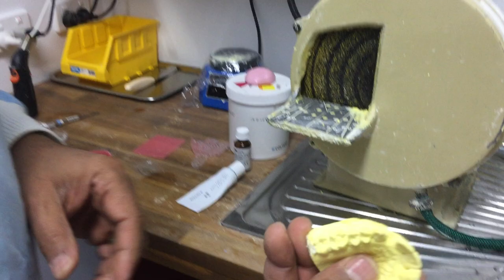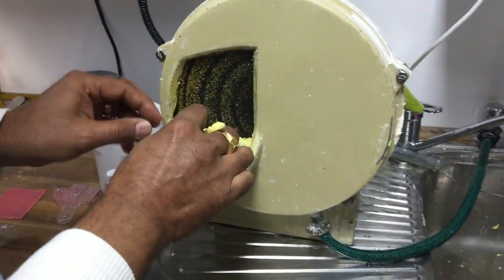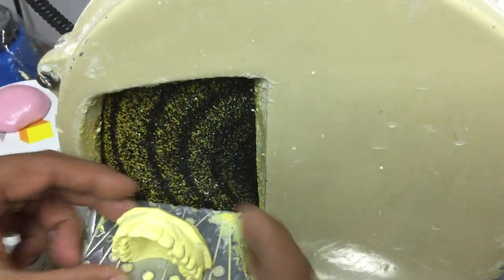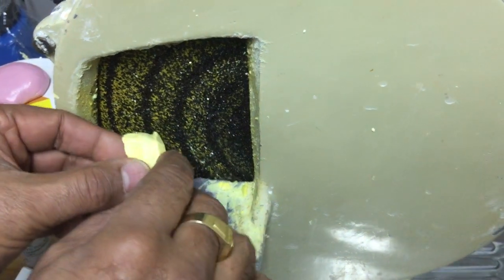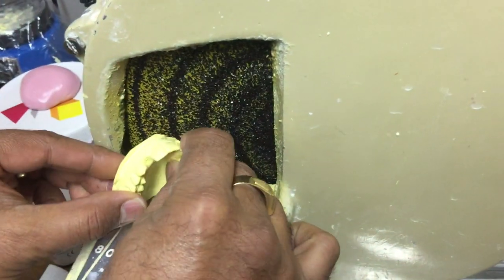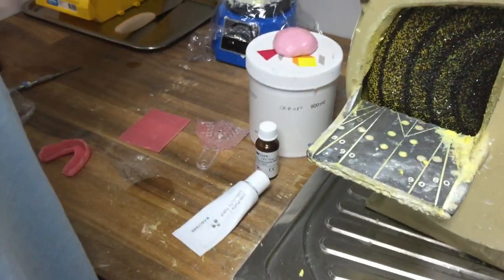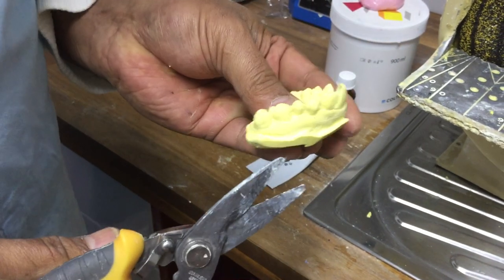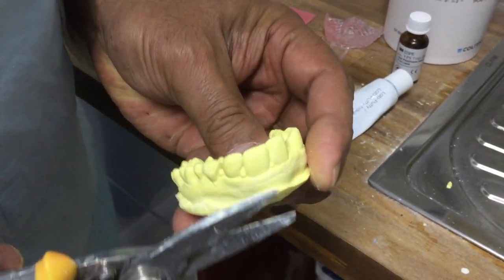Here is a model I've already trimmed. On the model trimmer, I start by holding it like this and trimming that part, then it rests and I trim that part. I then trim those areas as well. Because there's a bit of a ledge here, I use a plaster knife to just get rid of these bits.